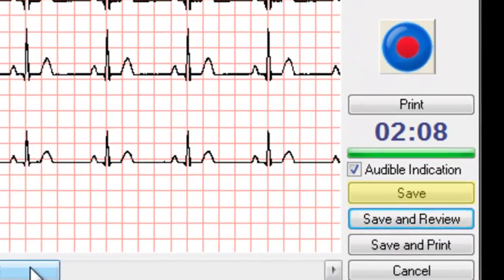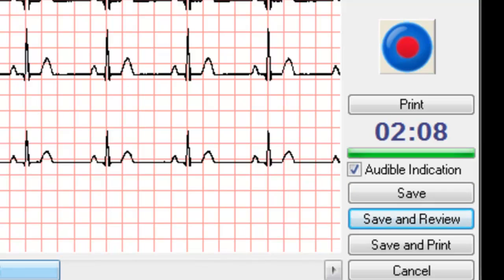Click Save to begin the filing process for your chosen segment. A further option that becomes available by clicking the Stop button is the Print button directly beneath it. If this is pressed, it will print off the trace for the whole of the monitoring duration, to a maximum of 15 minutes.